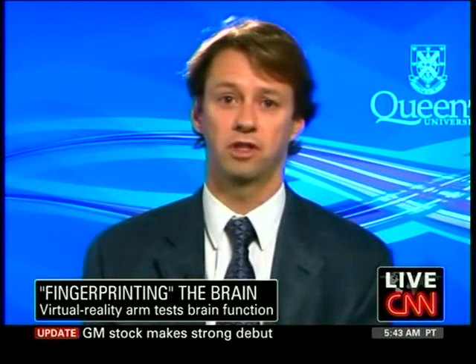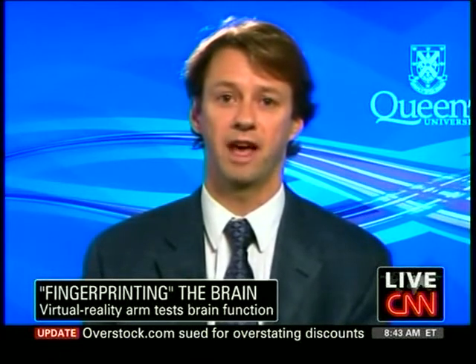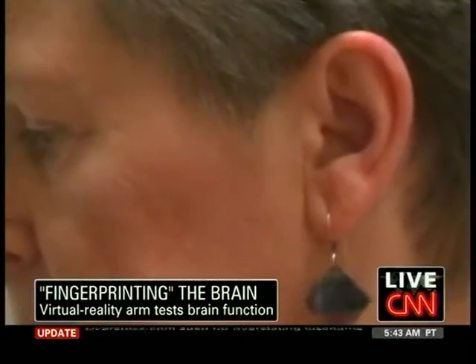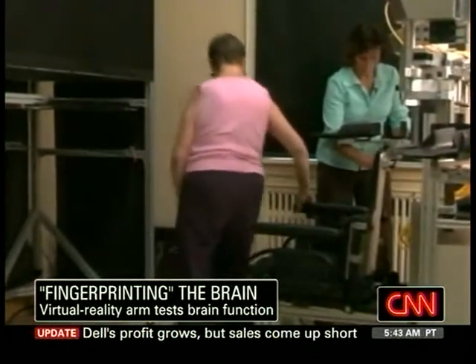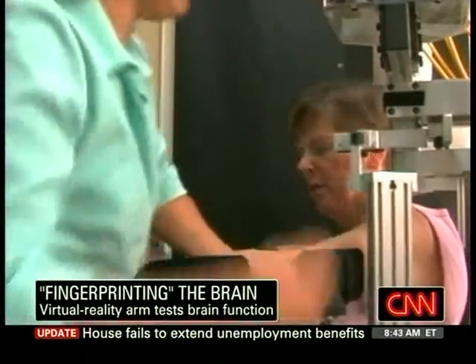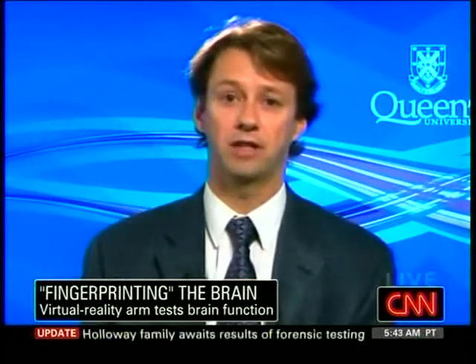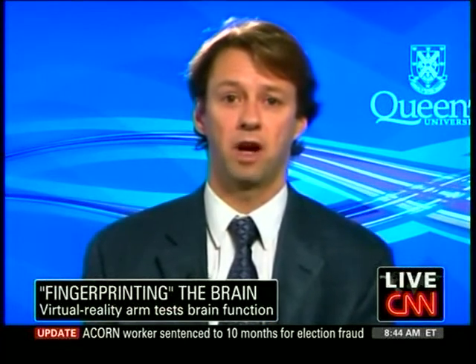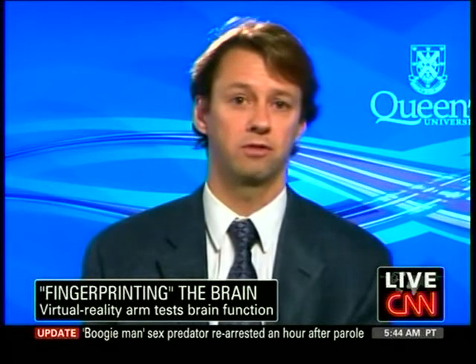We started with stroke just as a model system where it's very complex, the types of individual problems they have. And in this task, you can see that this stroke subject had severe problems being able to take the information from their limb, sensory information, to say where their arm is in space. And so this is an actual problem that there's very few good tools to measure this proprioceptive function. Right. And so it can be applicable to any possible disease or injury that affects the brain, and there is an enormous number, not just stroke.